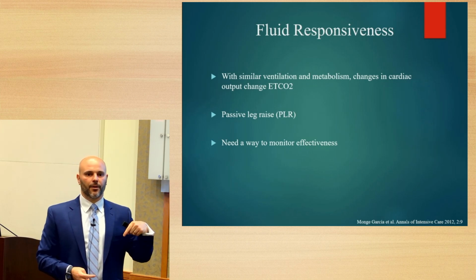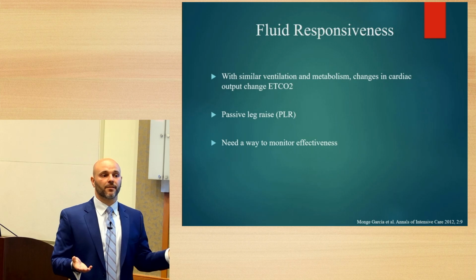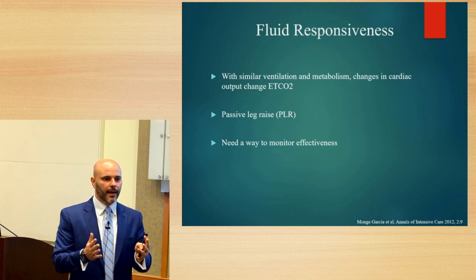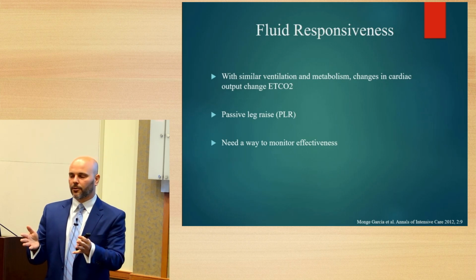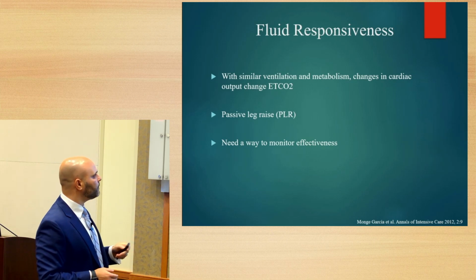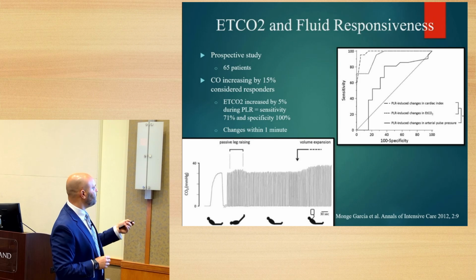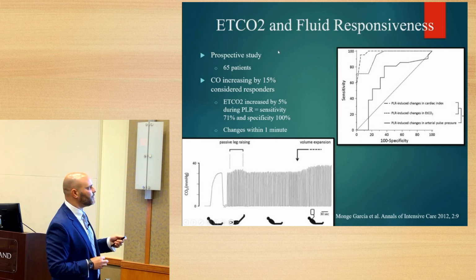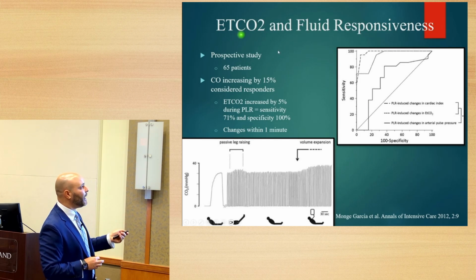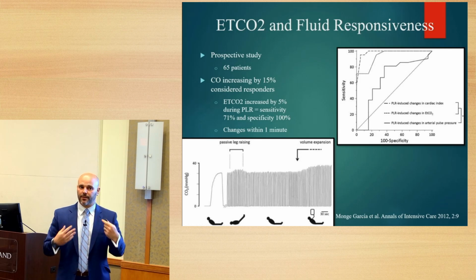Again, non-invasive, you could hook it up to the ventilator and check your fluid responsiveness with that, because you're isolating out your cardiac output for that. So in this study, they did a study, 65 patients, and said that patients who had an increase in cardiac output by 15% with passive leg raise were considered fluid responders.